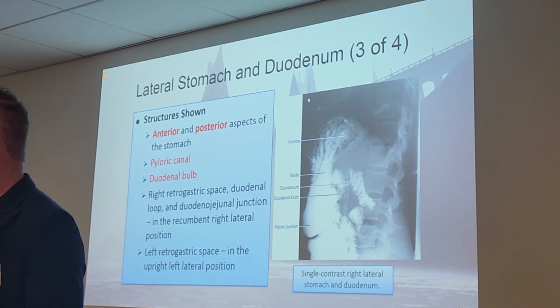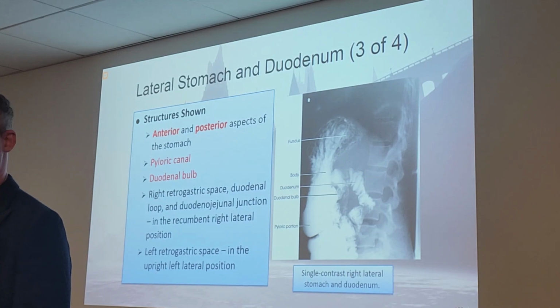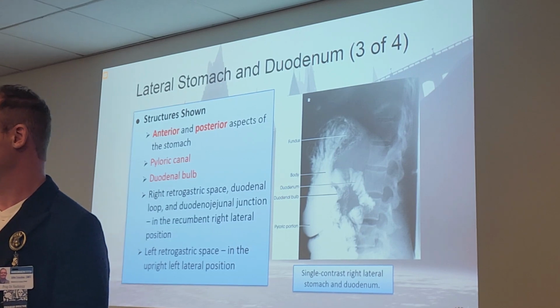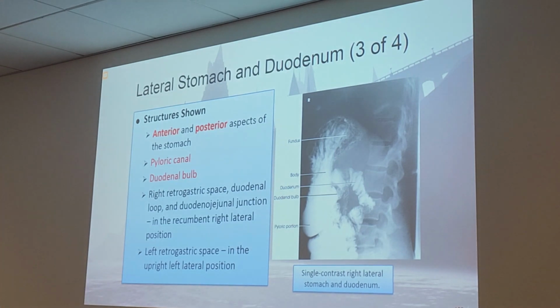To put it even simpler, we'll look at the front and back of the stomach on the lateral projection. Which one's the front? This would be posterior because the spine's posterior. That'd be your posterior portion. This would be your anterior portion.